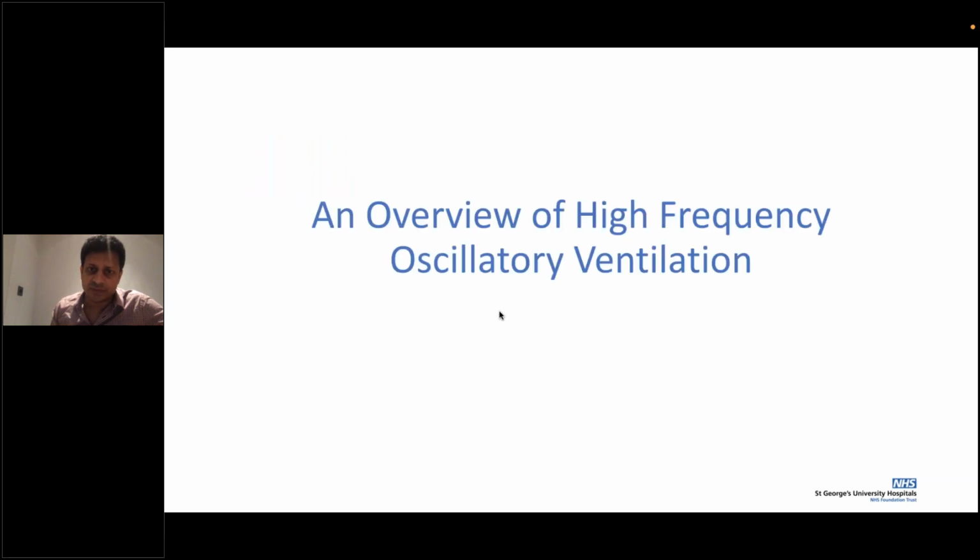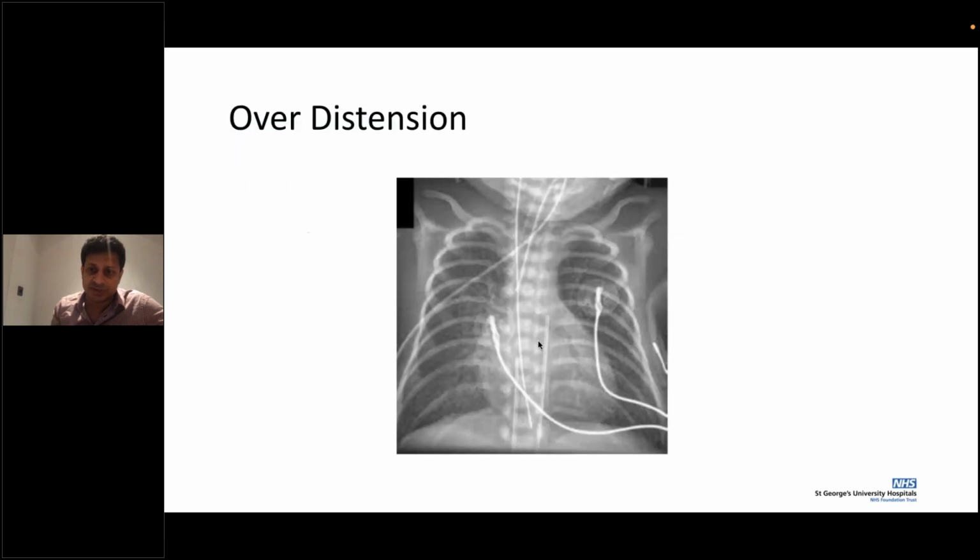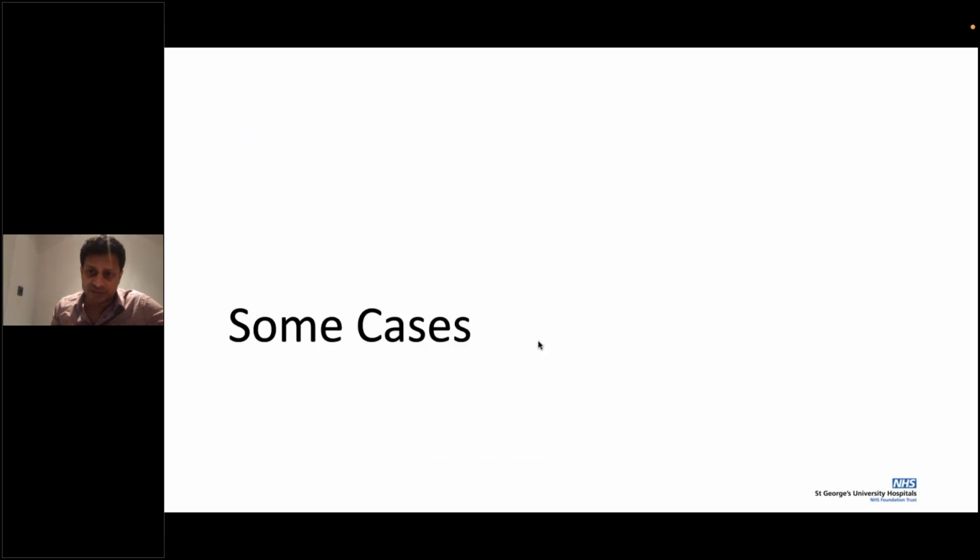So basically what we're looking at, on a restrictive mode you're restricting that 5 mils per kilo, keeping that Pmax reasonably high, so that the ventilator allows you the pressure. Or on a PTV mode, if you want a pressure mode of ventilation, you can limit the volume on some of the ventilators. So you can do it either way.